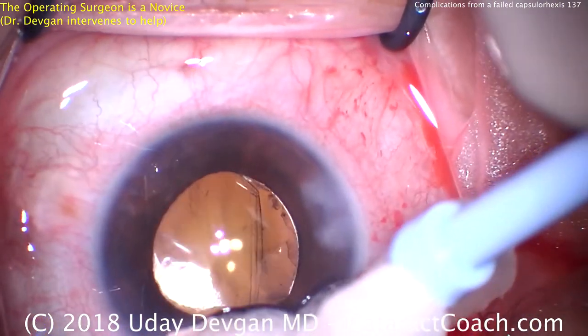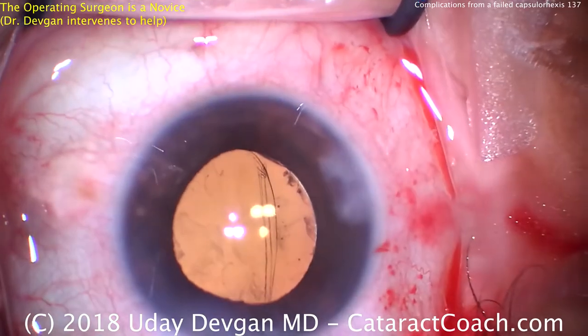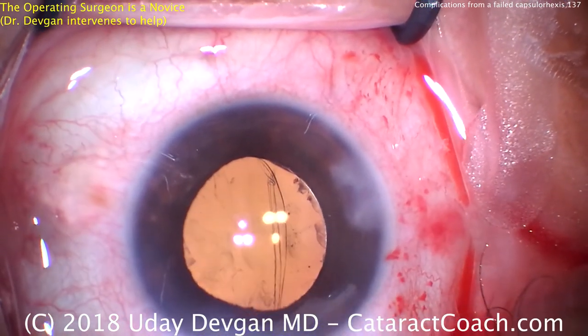So, what do we learn in this case? There are a lot of great pearls here, but most importantly, you've got to be very careful in creating your capsulorhexis. If it starts to go out, you need to stop and intervene.